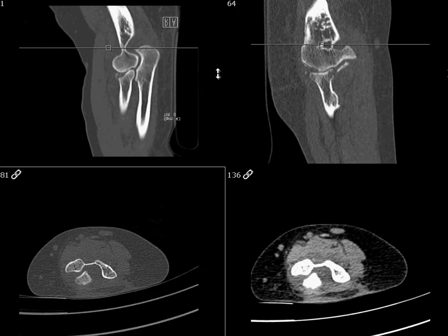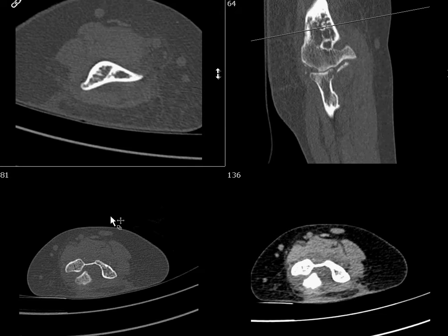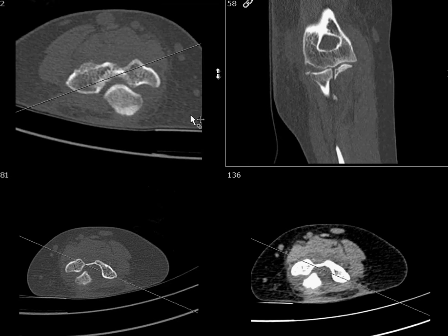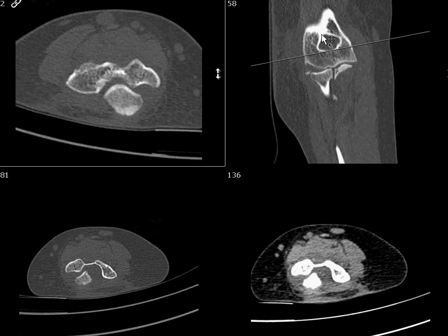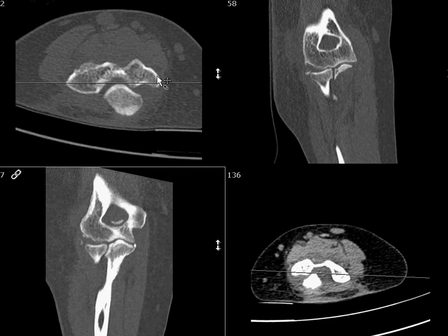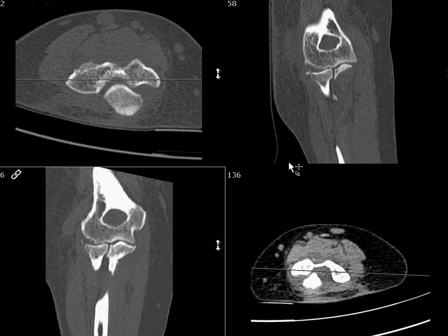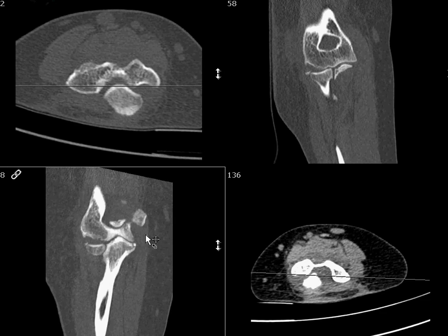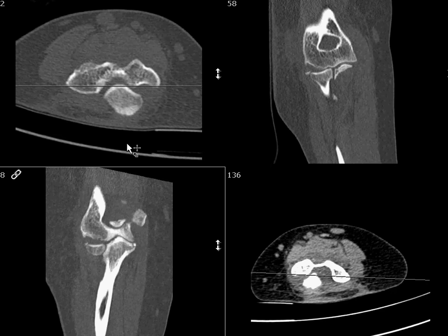Especially in the upper extremity, where the arm can move around all over the place, you want to make sure you use the correct imaging plane. So here, I made a new axial image that accounted for the bend or tilt of the arm. And then here's the coronal image made based on this — you see how it goes through the epicondyles, and it's less oblique. This is accidental in a way that it's horizontal to the tabletop; this was done because the epicondyle position was this way.